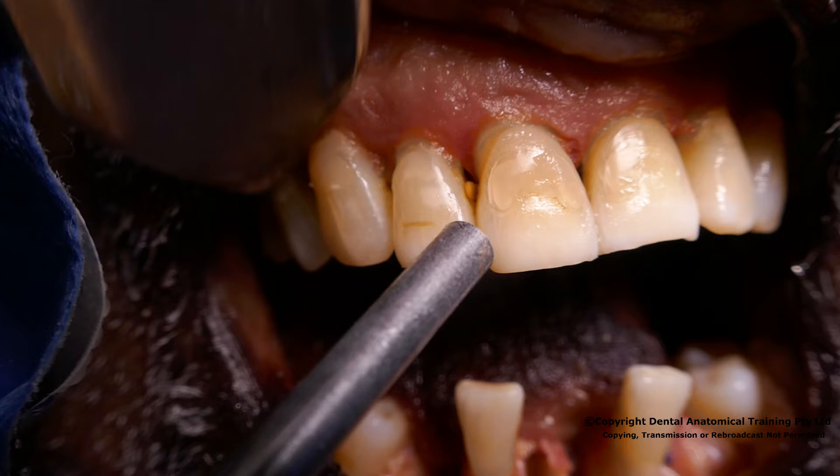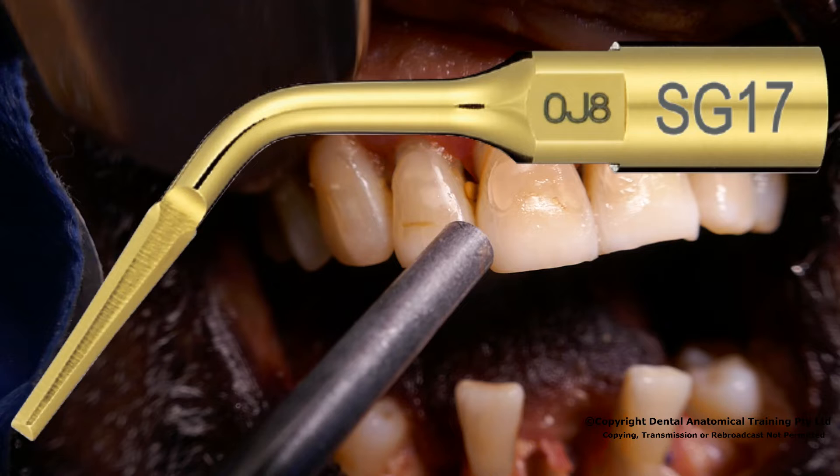On this cadaveric specimen we will remove the 2-1 and 1-1 teeth utilizing the various surge instruments. We will then raise a mucosal flap to demonstrate the amount of bony contour which can be preserved by utilizing these instruments. We will be using the SG17 blade, which also comes in left and right variants.